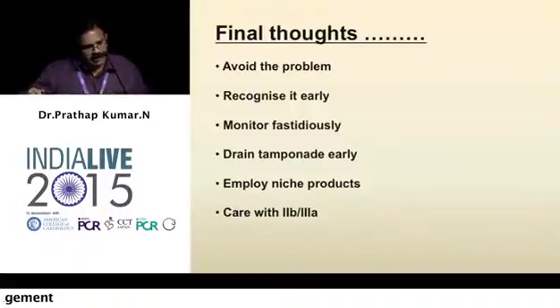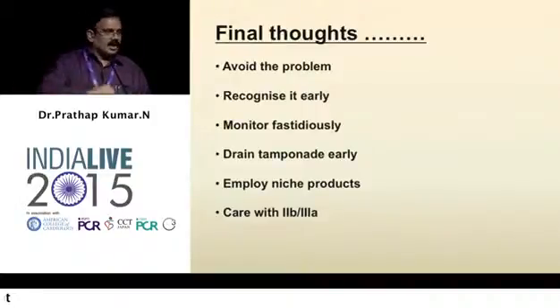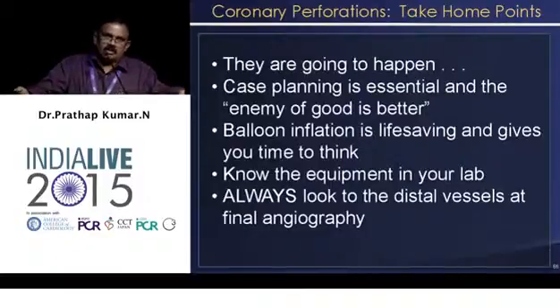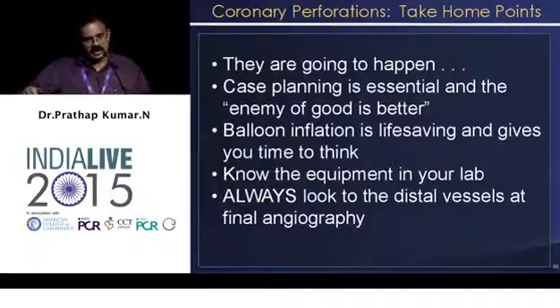Recognize if it occurs early. Monitor fastidiously. Drain tamponade early. Employ niche products. Care with glycoprotein 2B3A. Coronary perforation take-home points: they are going to happen if you are a very good interventional cardiologist or if you want to do some complex interventions.